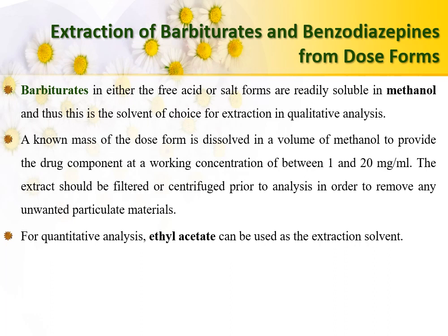A known mass of the dose form is dissolved in a volume of methanol to provide the drug component at a working concentration of between 1 and 20 mg per ml. The extract should be filtered or centrifuged prior to the analysis in order to remove any unwanted particulate materials. For quantitative analysis, ethyl acetate can be used as the extraction solvent for barbiturates.